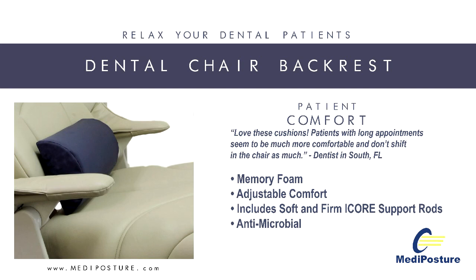Infection control is easy. All Metaposture dental backrests are covered with a medical-grade urethane material that can be cleaned using infection control solutions commonly found in a dental operatory.